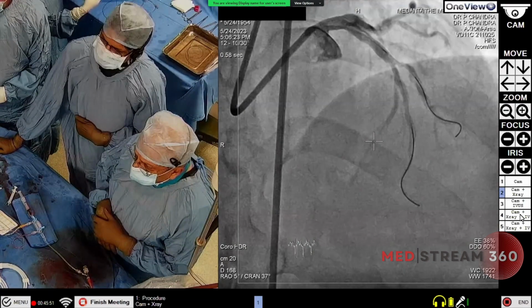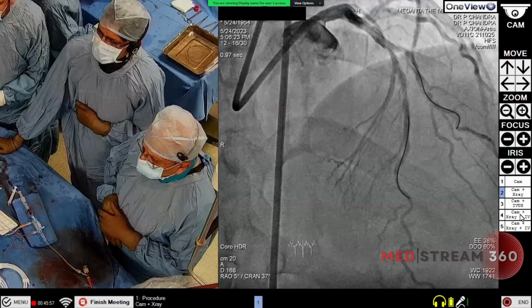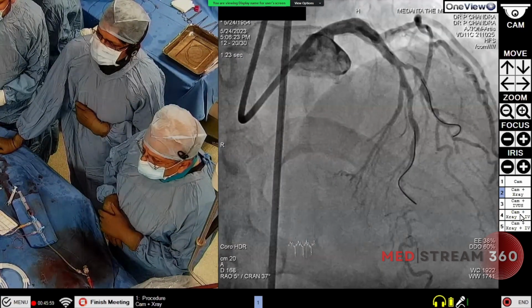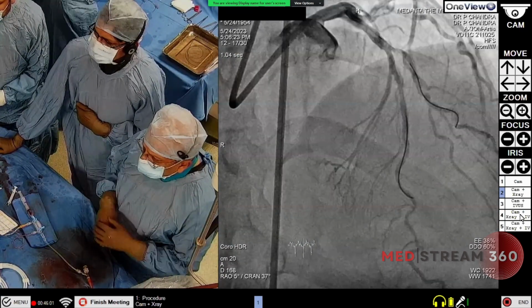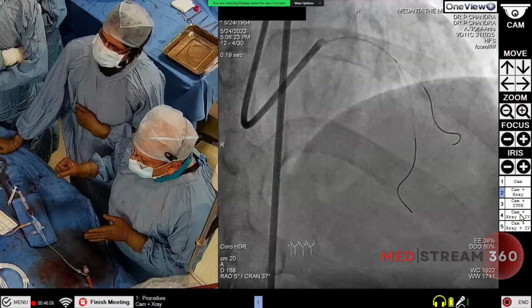Yeah. Maybe the distal part. The axis is also doing fine. It is the straightening effect of the whole thing. There is no dissection at all. Now you see that there is nothing, no dissection. Lumen looks good. The side branch is flowing well.